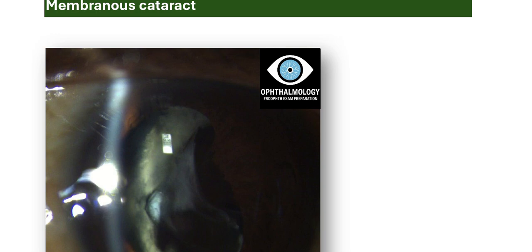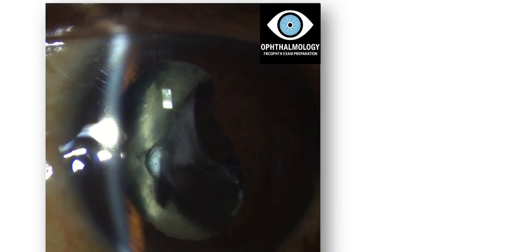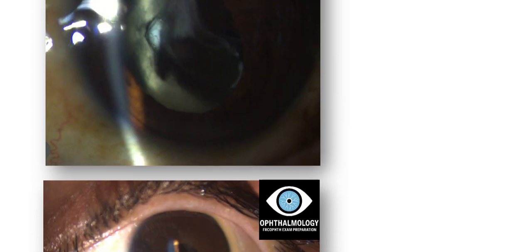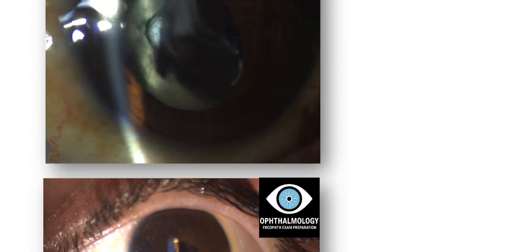is membranous cataract. This cataract happens when there is resorption of the lens material and fibrosis of the anterior and posterior capsules. These are two different patients, and both patients were adults actually, above 30.